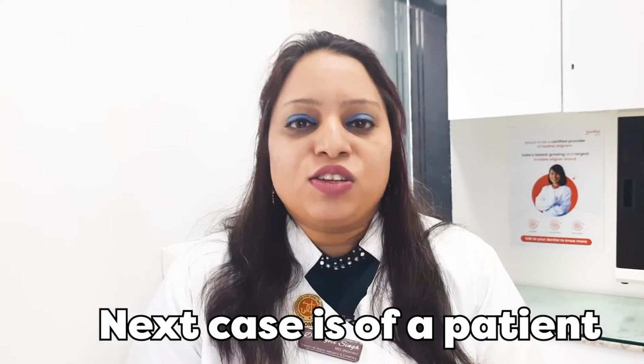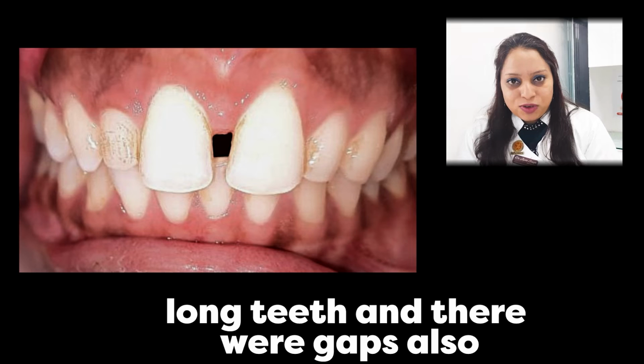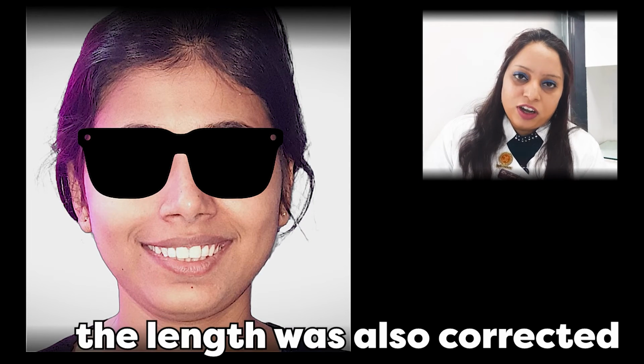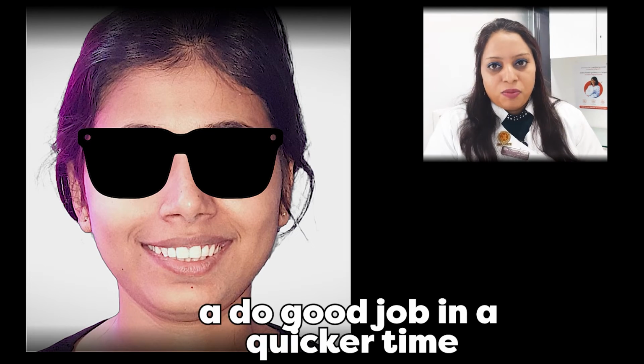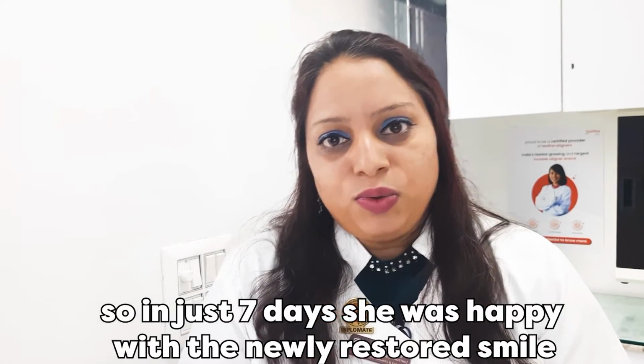Next is a patient who reported to us with long teeth. There were gaps also. She was not happy. So we did 4 Emax veneers for her. The length was also corrected. So you can see veneers can do a good job in a quicker time. In just 7 days, she was happy with the newly restored smile.